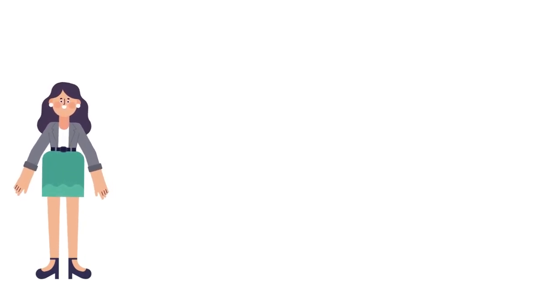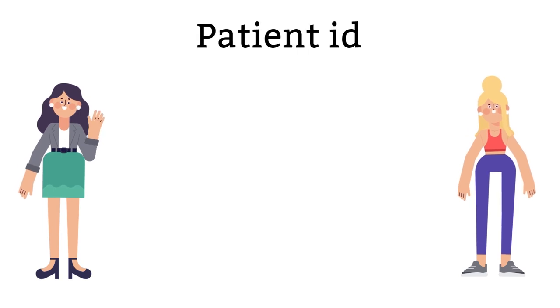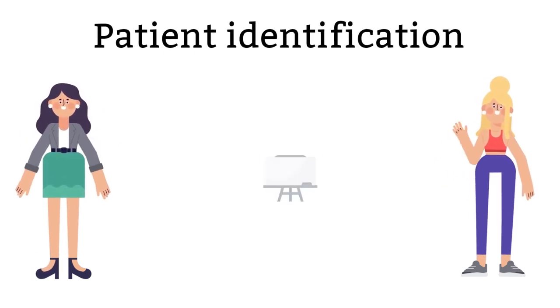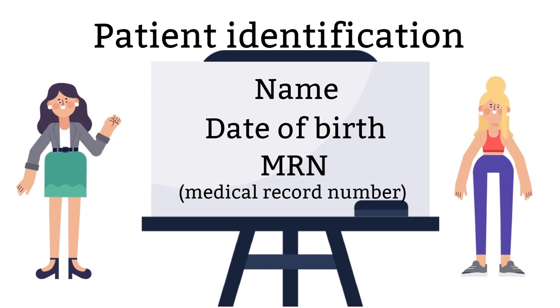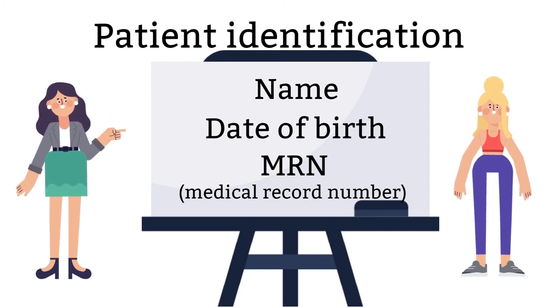After you have identified yourselves, you will have to identify the patient. Correct patient identification is key to patient care. Wrong identifications can lead to wrong diagnosis and wrong treatment. Ask the patient for their full name and date of birth or medical record number. Do not forget to check the patient armband if you are drawing an inpatient.